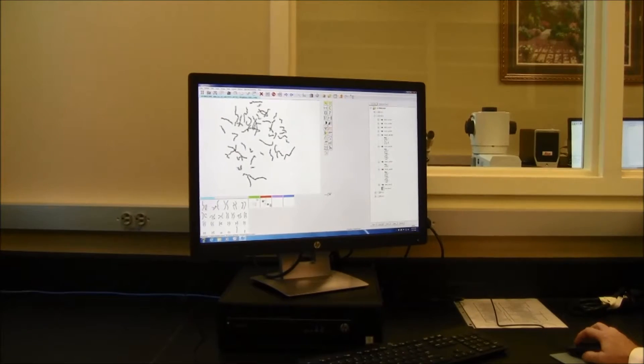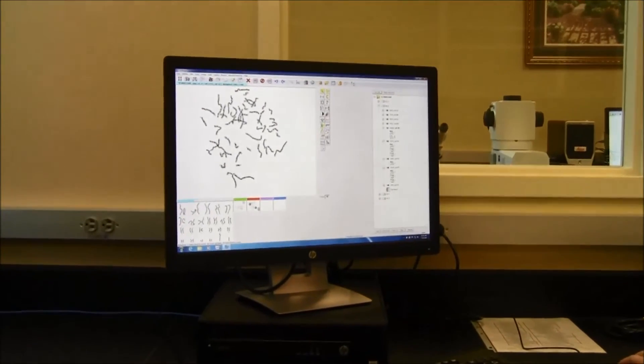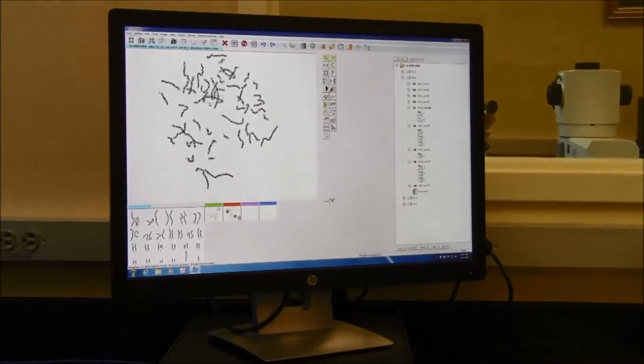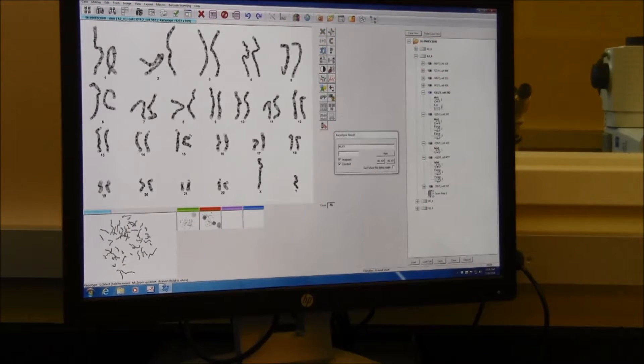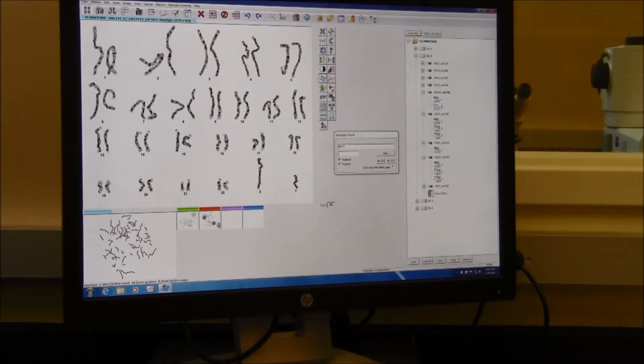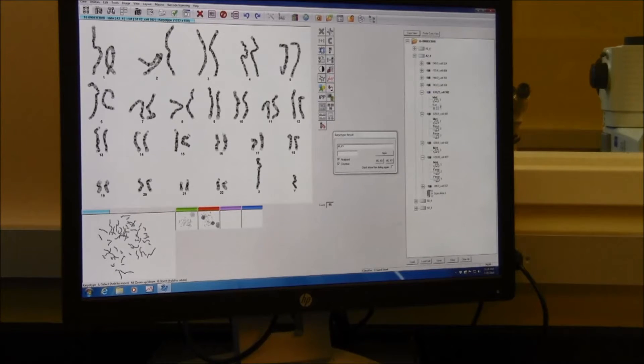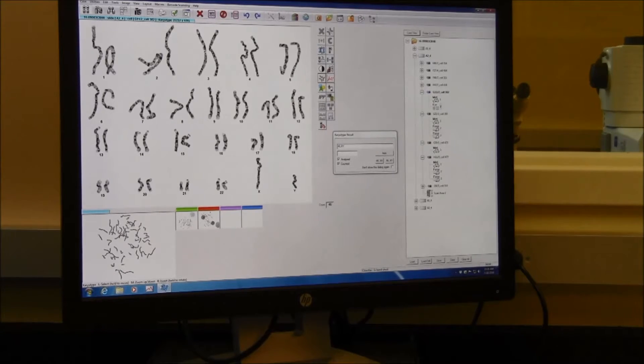Here is a picture of a metaphase from our patient. The program allows us to clip these apart and arrange them on a karyotyping board that allows us to put them side by side and check for any kind of structural or numerical abnormalities that the patient may have. Once the analysis is completed, a report is generated and signed out by the director of the cytogenetics laboratory. These results are then sent to the ordering physician who will use this information as part of the patient's health care management.